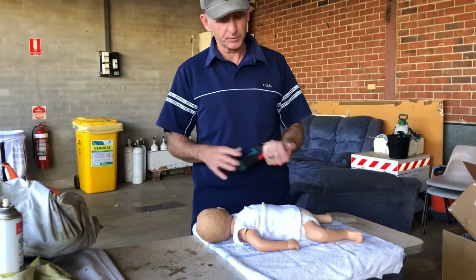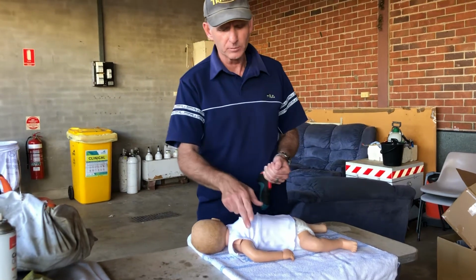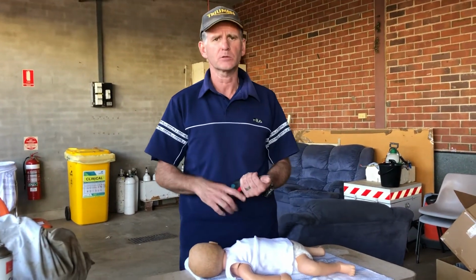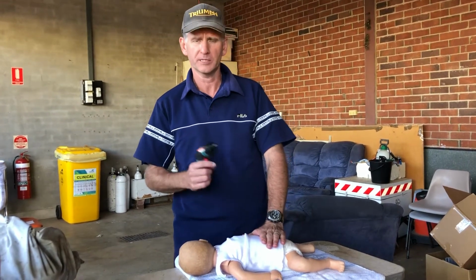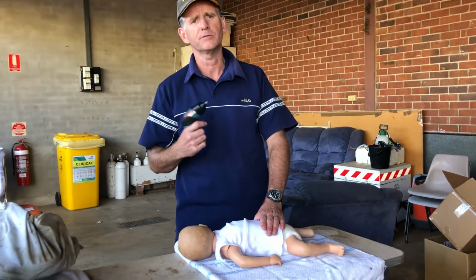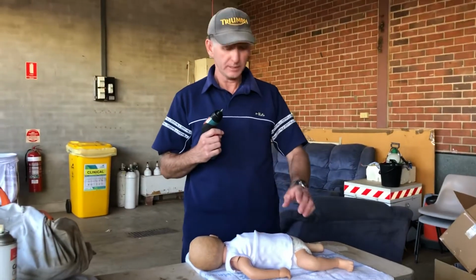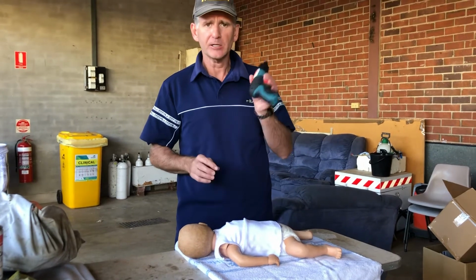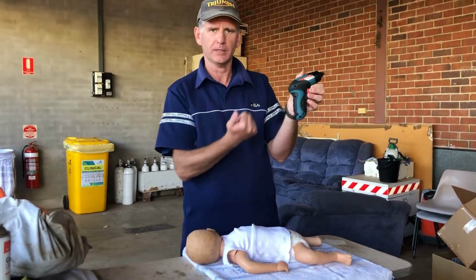As such, we've noticed that the child has been unwell, is running a fever, and also has some petechial rashes and non-blanching rashes. So we've decided that we're dealing with a potential meningococcal septicemia, and so we want to give some antibiotics. We also want to give some fluid therapy. Because the child is so shut down, we need to put an intraosseous needle in. We're using the Arrow EasyIO, which is the best on the market, the best the money can buy.